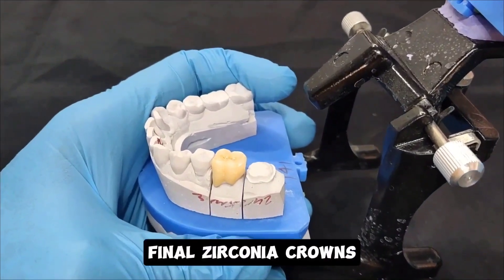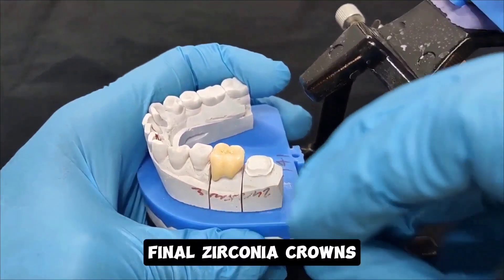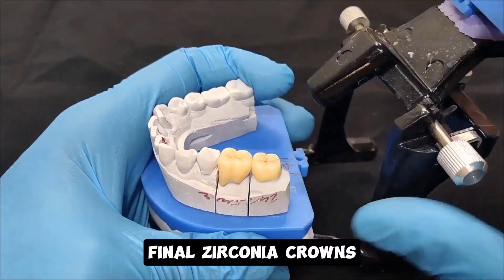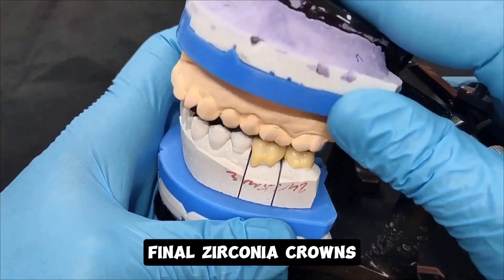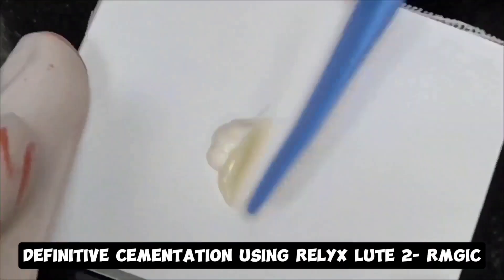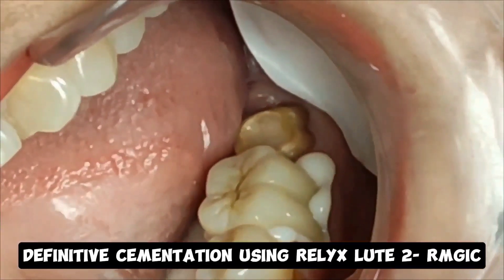A good quality provisional allows for my final restorations — which in this case are monolithic zirconia crowns — to go ahead and seat those gingival margins beautifully. It is very important for me to get the marginal fit and seal correct.